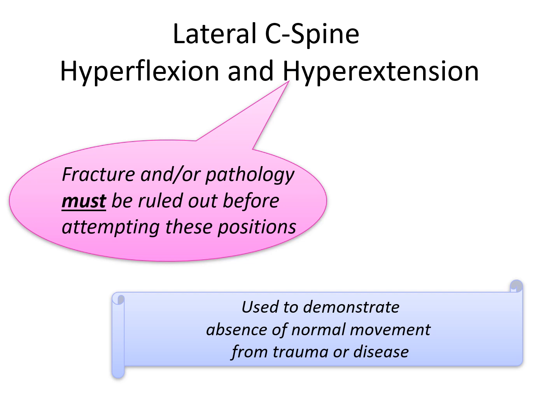Typically these are like 6 weeks post-surgery, and they're trying to assess range of motion. What surgery affected range of motion? They're going to raise their chin up, and then you're going to recenter to the new mid-coronal plane. It will shift. When they raise the chin up, typically it shifts posterior, and you have to make them take a baby step back. For hyperflexion, they tuck the chin to the chest, and usually the center shifts anterior, and then they have to take a baby step forward to recenter.